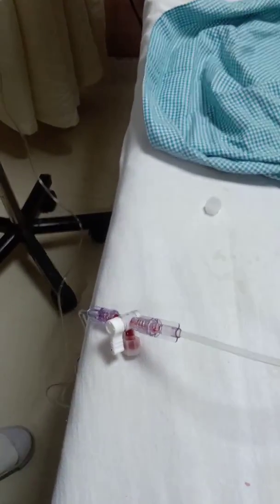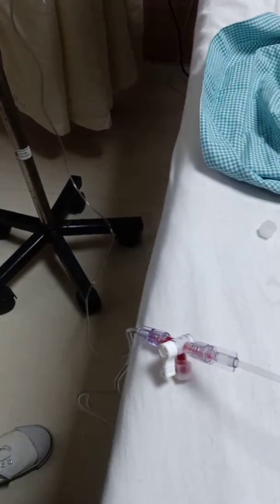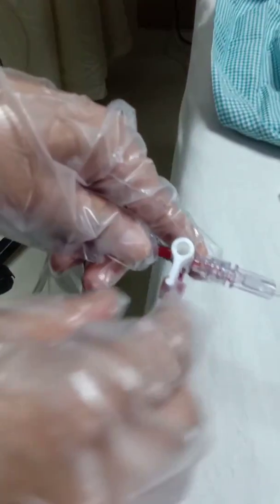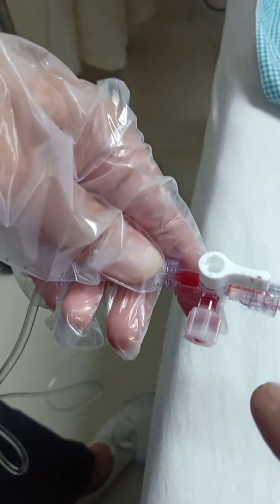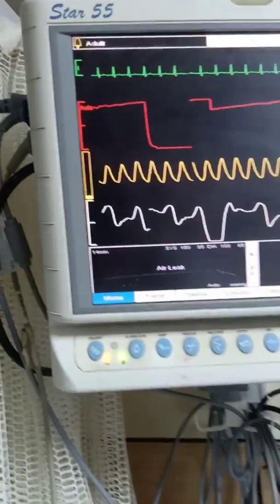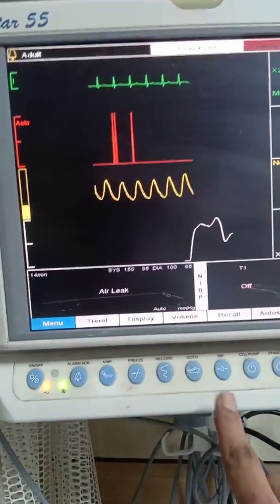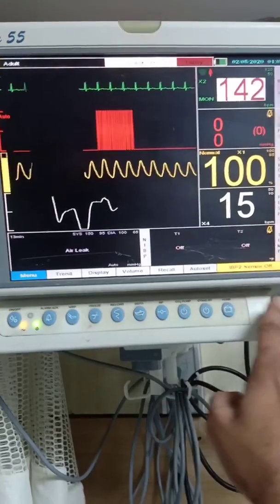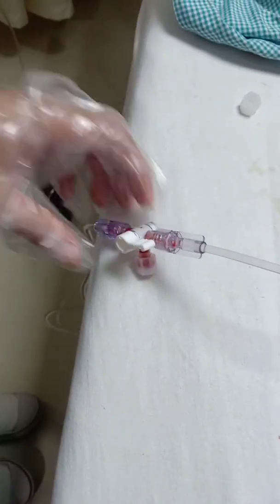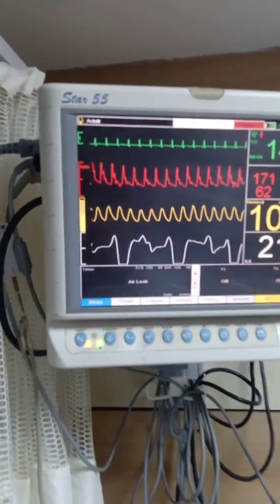Whenever we set up the arterial line for the first time, we have to zero it with the transducer at the level of the heart. We close the port towards the arterial side so the catheter line is open to atmosphere, then go to the monitor. We press the IBP zeroing point, accept it, and watch the pressure come to zero reference. Once at zero reference, we close the port to atmosphere and open the arterial line to the catheter, then observe the graphical presentation.